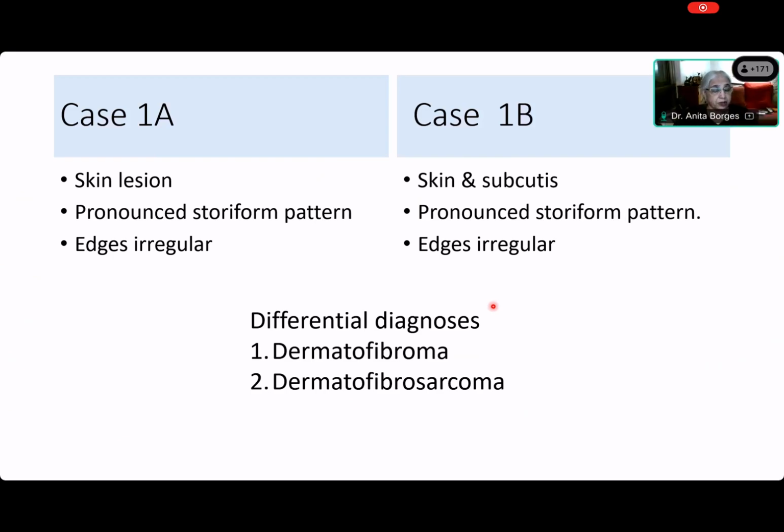Somebody just said no, deep. You said no, that it was a deep fibrous histiocytoma. Did you say? I don't know who said. Shashank? I said it for 1A, ma'am. You thought it for 1A. All right. Deep. Okay. Shashank is not there. Okay, Kedar? Ma'am, I thought of these two entities as well. You thought of two entities for 1A. So now, these are the only two entities which will have a pronounced storiform appearance. What is the fibrous histiocytoma if you're going to call it benign? It's nothing but a dermatofibroma. Okay, that's another name for a dermatofibroma.